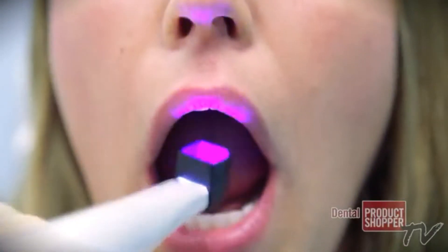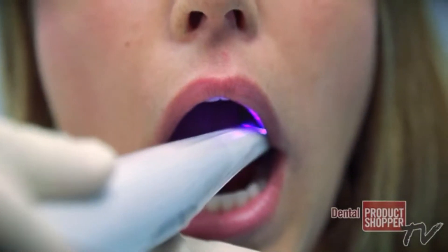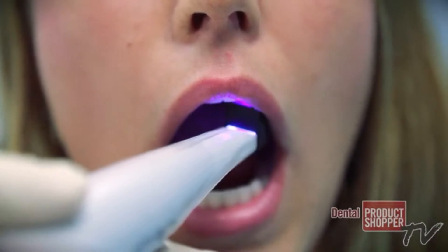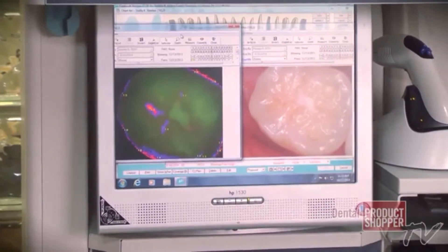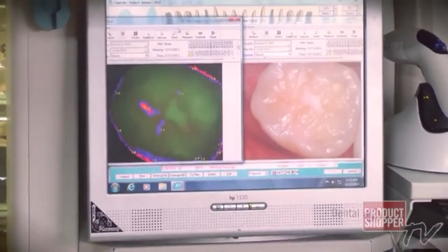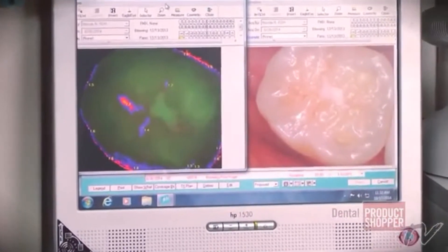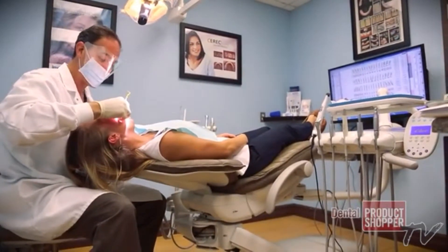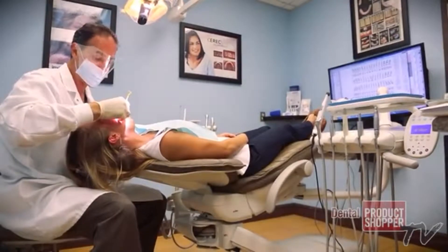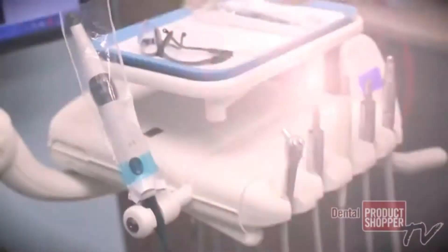If we use the Spectra by Air Techniques as one of those devices, it allows us to show patients what is going on in their mouth, to better diagnose what's going on, and show the patient ultimately what kind of treatment they're going to require. That allows us to determine the depth of bacteria within the tooth structure to help the patient make the decision whether they should move forward with getting the treatment.